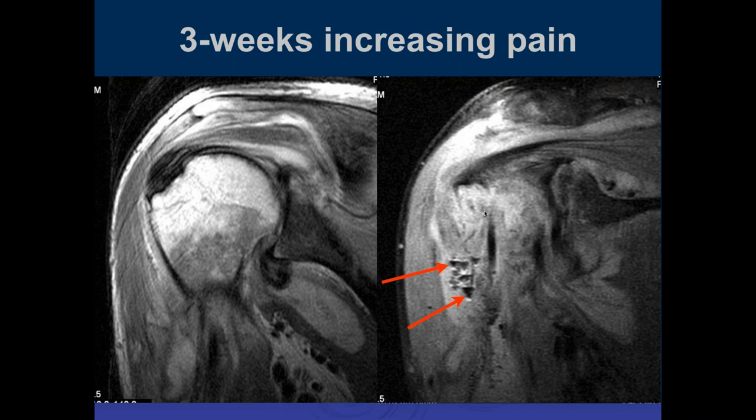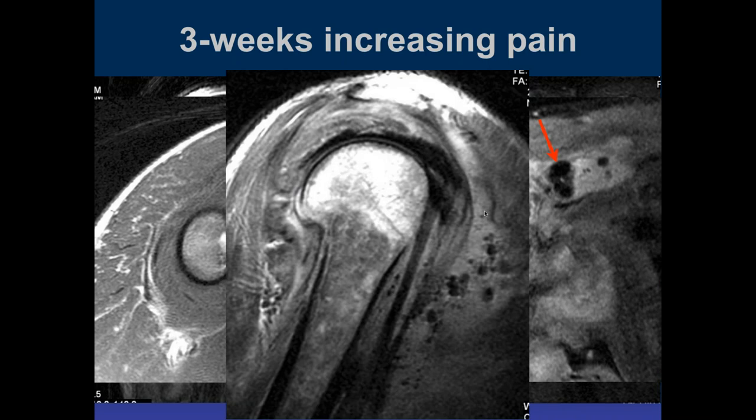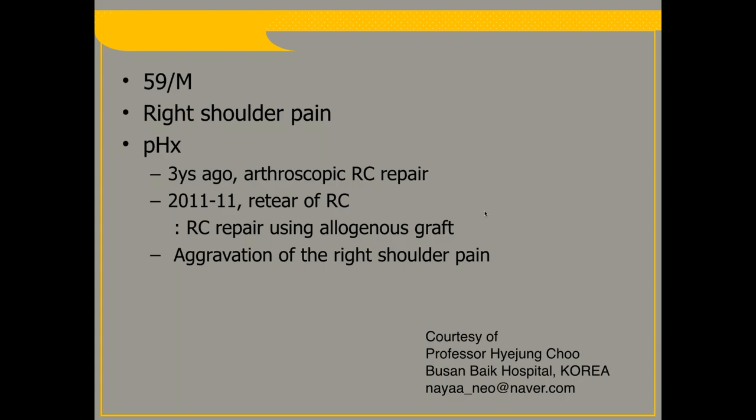Yeah, the proximal humerus. Anaerobic? Yes, I guess, if that's some foci of air. Okay. Excellent. Anaerobic. That's gas, isn't it? Yes, John. You gave it away. So this was an anaerobic infection. Oh, shucks. Well, geez, I was right. You were, absolutely. I'm sorry about that. Couldn't resist.